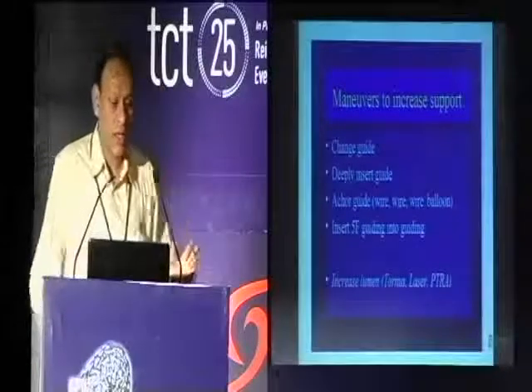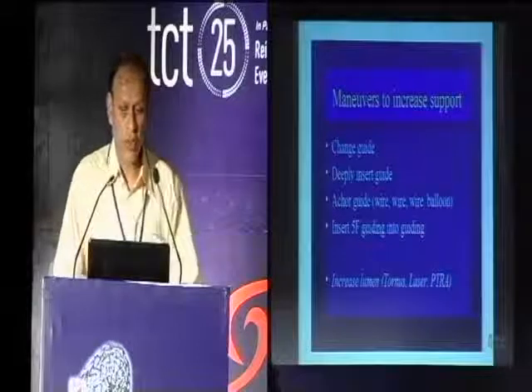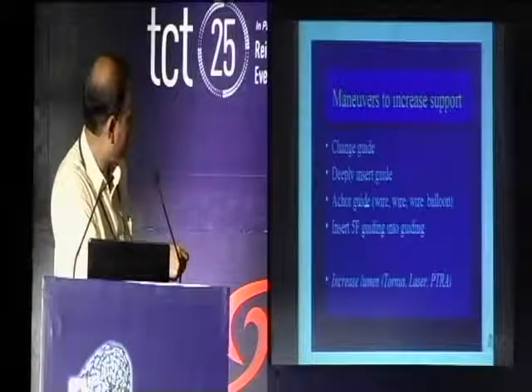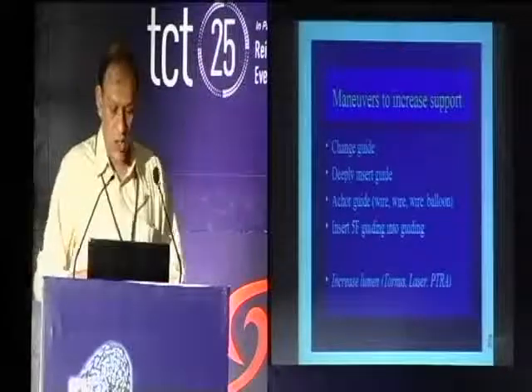So what are the maneuvers you do to increase the support? You could change the guide, you can deeply insert the guide, you can use an anchoring guide or an anchoring balloon technique, or insert a 5 French guide into the guiding catheter.